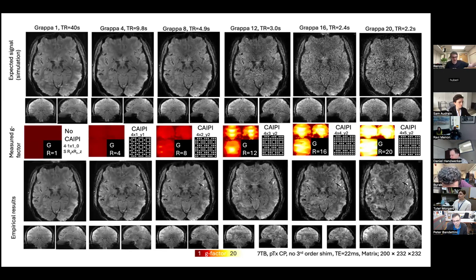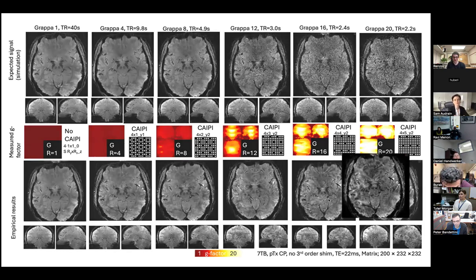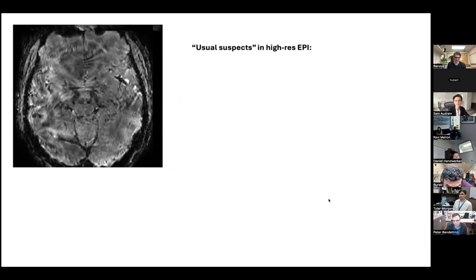Though it is still funny how it breaks down, given that Steve Moeller had a 60-channel coil with an acceleration factor of 16 in the 2010 paper, right? Anyway, the take-home message here is that we have these artifacts, and we need to go through the hurtful business of looking at the ugly part of our data to try to understand what is causing them.